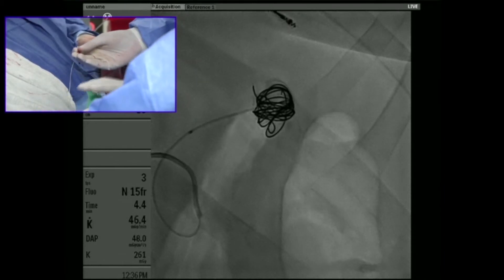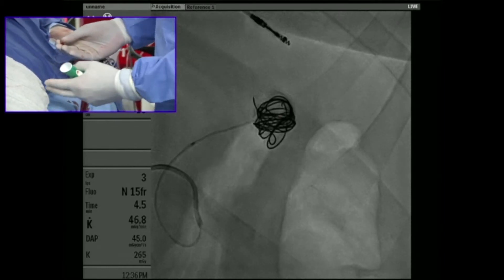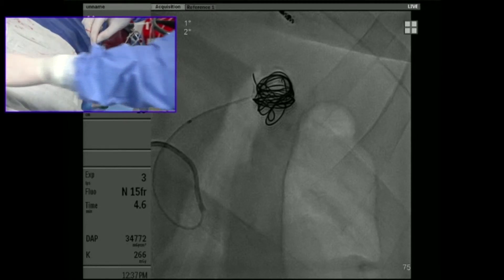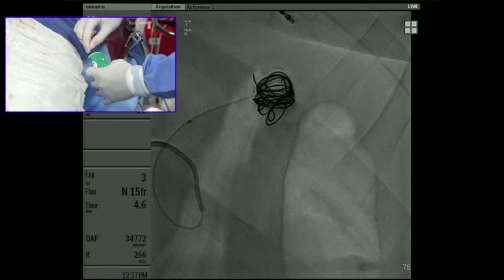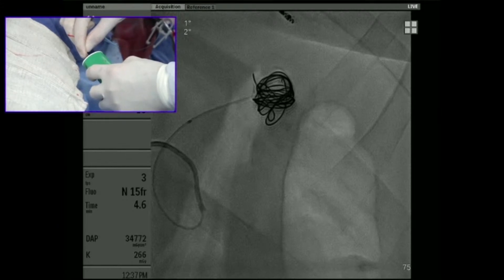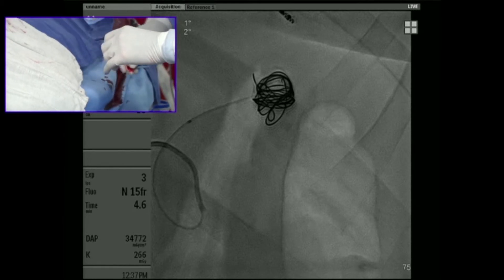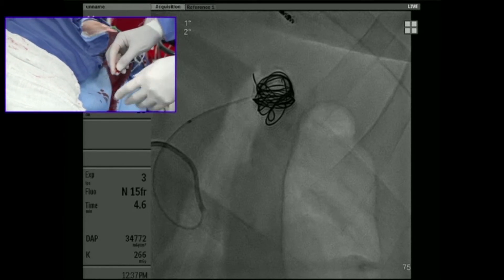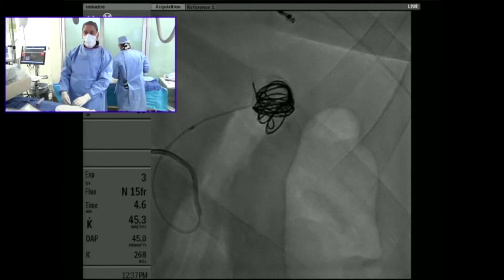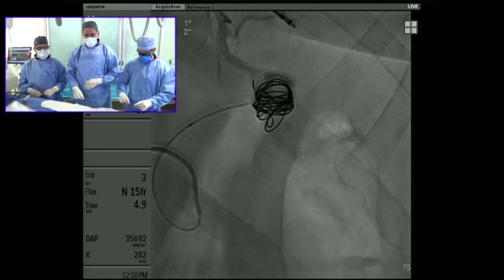There is a handle that allows the coil to be detached via an electrolytic process. The back end of the coil is introduced into the handle — you can see there's a light — and then I activate it. You saw those lights blink, which confirms that I've detached the pusher wire from the coil. Now as we go back to the simultaneous screens, I retract my pusher wire and you can see the coil is not coming back.